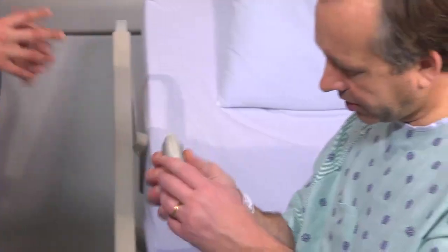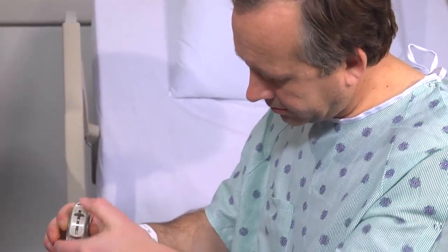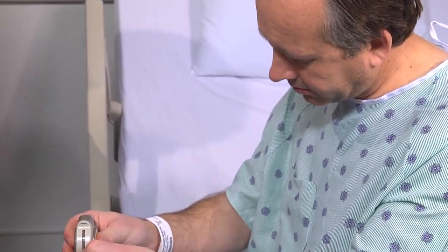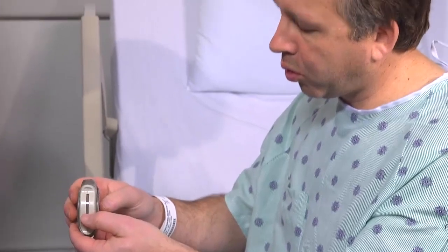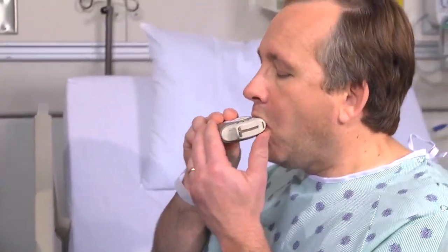Here you go. Next, teach the patient the correct method to use for inhaling the medication from the device. When you are sure the patient is ready, have him administer an actual dose. Sharp breath in. Be sure to follow the manufacturer's guidelines regarding how quickly the patient should inhale the medication. 7, 8, 9, 10. Out through pursed lips.